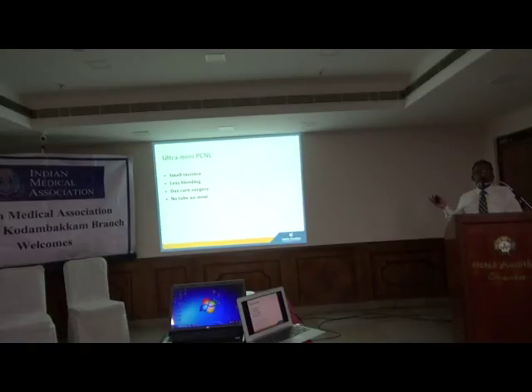And there are no tubes, no stents, and no role for a forgotten stent or anything. But it has a very limited scope. It is not indicated for complete staghorn. Complete staghorn is still a standard PCNL or a mini PCNL. So that is the main disadvantage.